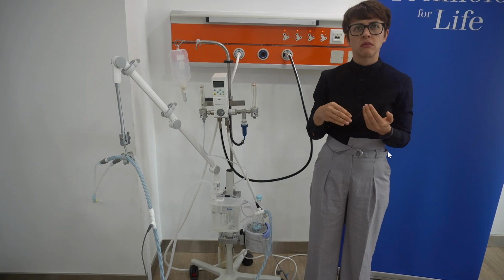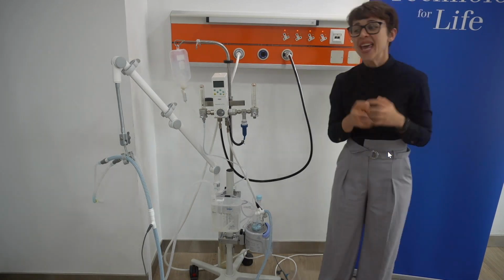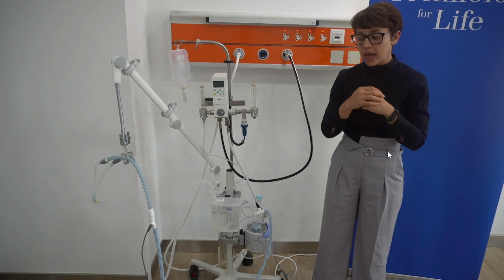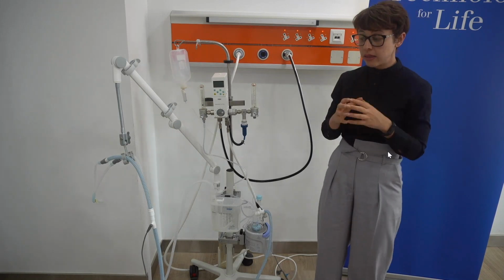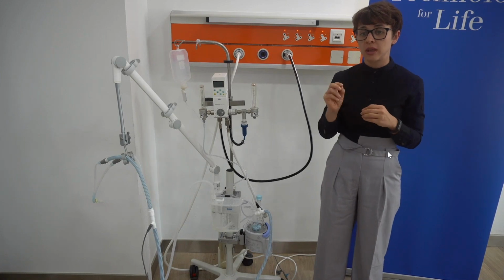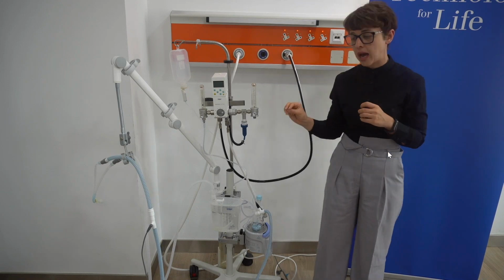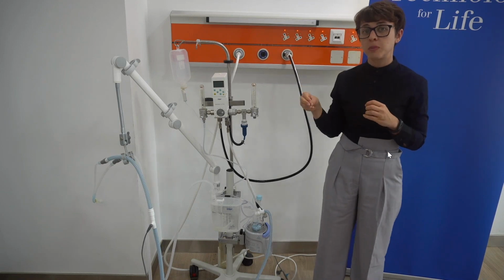Other way around. Yes, in mechanical ventilation, the inspiration is active, so the machine is pushing the air into the lung, and the expiration is passive.